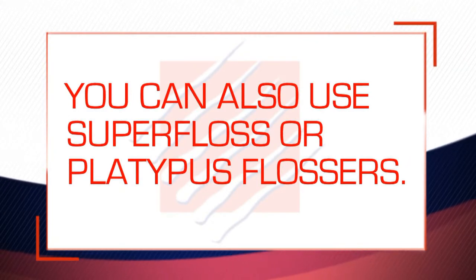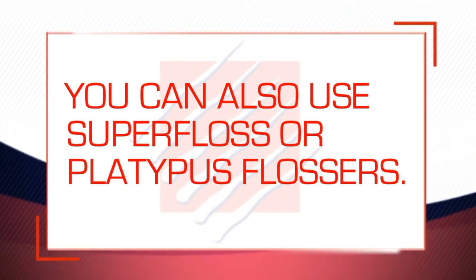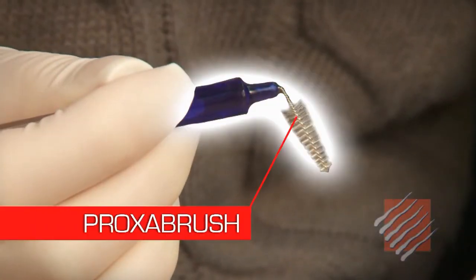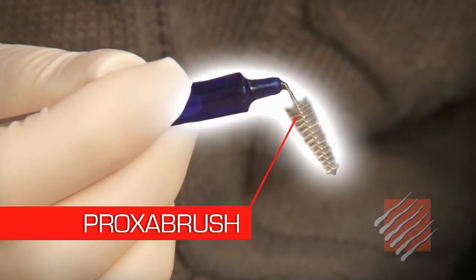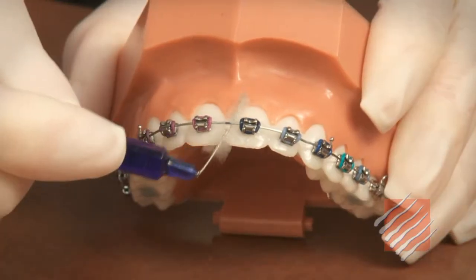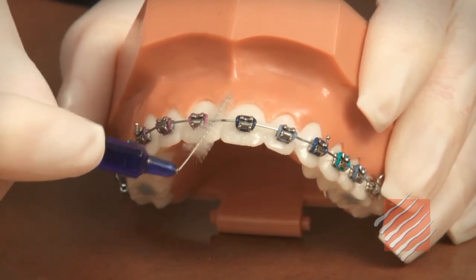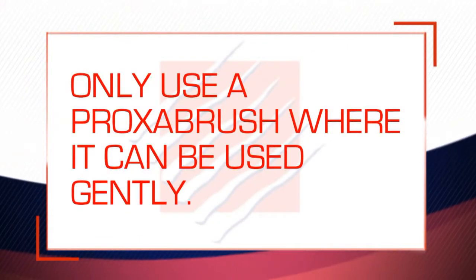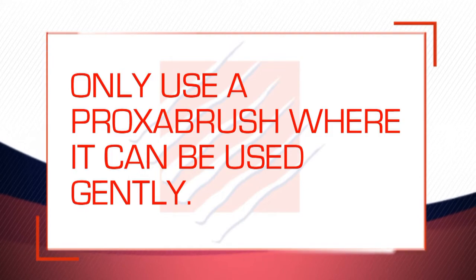Some patients like to use things like super floss or platypus flossers, which again, you can buy down at your local pharmacy. These little things, called PROXABRUSHES, can also be used between the arch wire and the braces to help loosen food particles, remove plaque, and stimulate your gums. To use them, simply push the brush gently under the arch wire between brackets. Now, if it's too difficult to push the brush into an area, don't try to force it, because you might accidentally break a bracket loose. So only use the PROXABRUSH in those areas where you can be sure and use it gently.